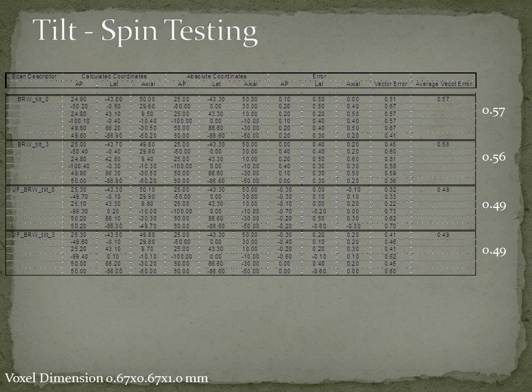We can do all of those tests I just talked about. And when we do all of those tests, and we do this very often, we take it and square it up as best we can, and we look at the overall accuracy of all of those. These are the known coordinates. These are the calculated coordinates. These are the errors. And the overall vector errors turn out to be about the size of an in-plane pixel, which is about as good as you can do in imaging.